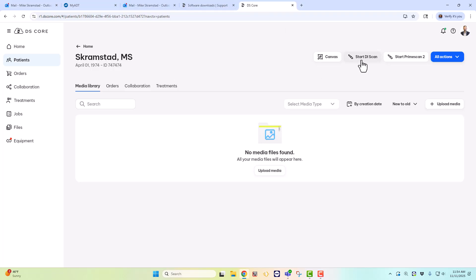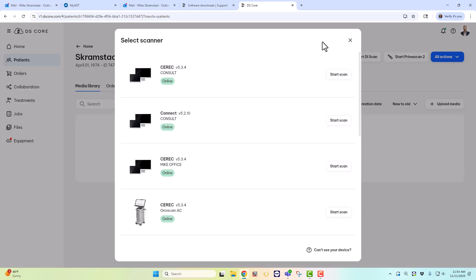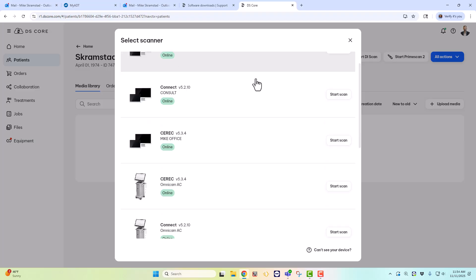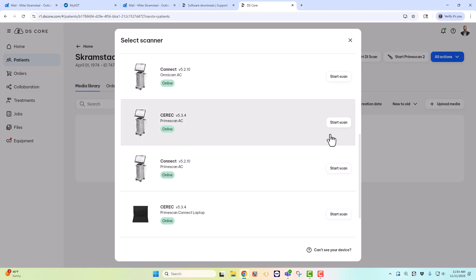Select Start DI Scan. Now if you have the PrimeScan 2, of course we're going to use the PrimeScan 2. But if we start DI Scan, then it's going to basically select every scanner you have available in your office. Now let's say I want to scan on the PrimeScan AC, which is the Acquisition Center, I can either scan in the CEREC software or the Connect software. Now once I select Start Scan, this software with the correct patient name, date of birth, all that stuff, is going to open up remotely on that PrimeScan AC and allow you to scan. Once you're done scanning, that scan will automatically sync to the correct location on DS-Core.